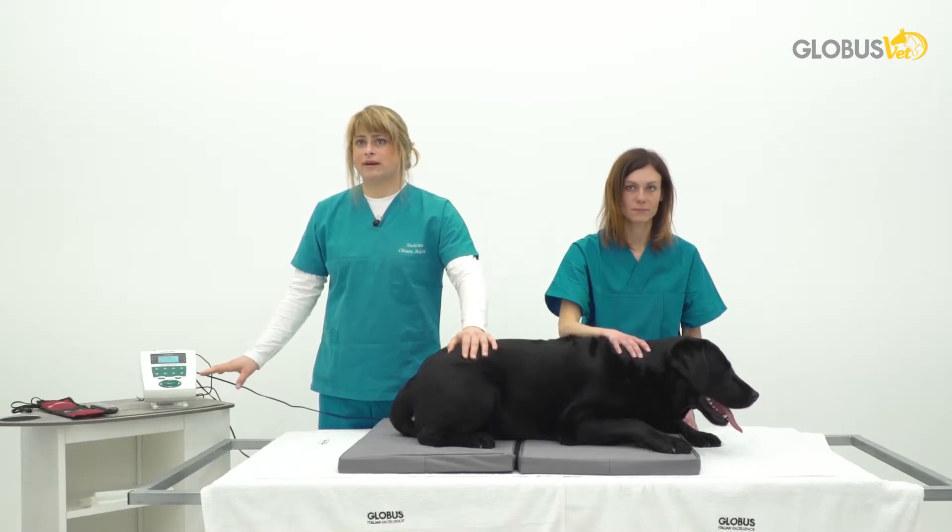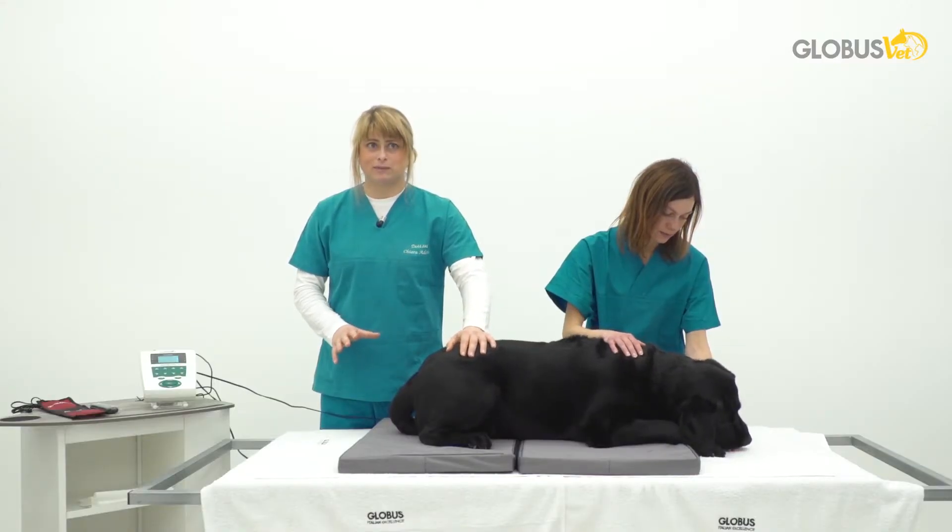The mat will work automatically on the preset program. Underneath each mat there are four solenoids that will irradiate their energy throughout the body of the patient.